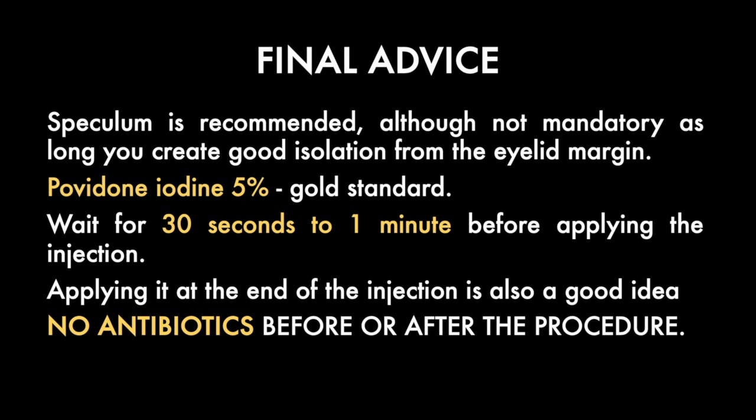The use of gloves is also optional, with no clear evidence showing a significant advantage. However, povidone iodine at 5% is crucial. Studies have demonstrated that even more diluted povidone iodine at 1% or 2% can also be highly effective and reduce ocular irritation. I recommend applying povidone iodine 5 to 10 minutes before the injection, immediately before the injection, and waiting at least 1 minute. If unable to wait a minute, wait at least 15 to 30 seconds as the evidence suggests. Post-injection, I do not use antibiotics, but only ocular lubricants, which I find sufficient, and I also apply 1 drop of 5% povidone iodine at the end of the injection in the puncture site.